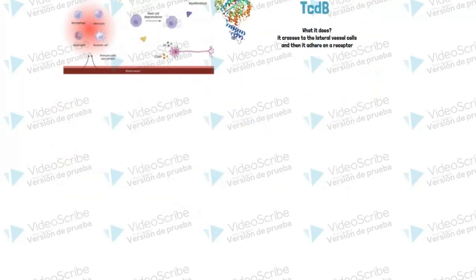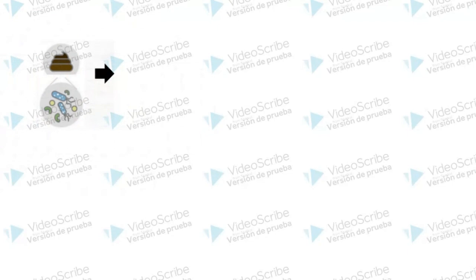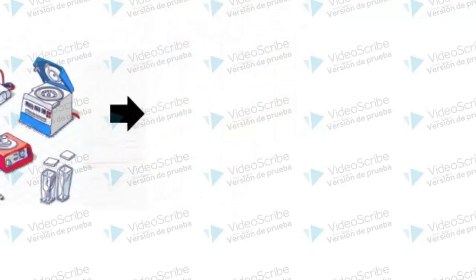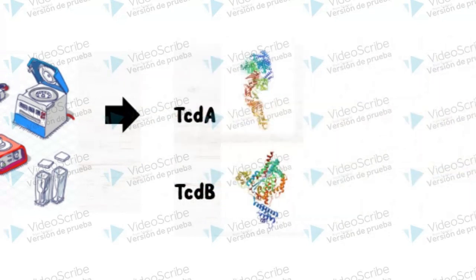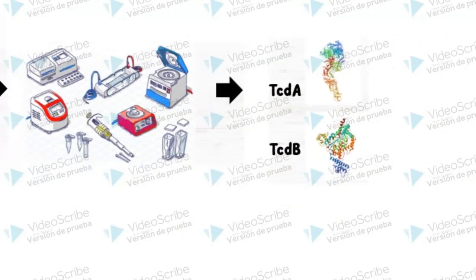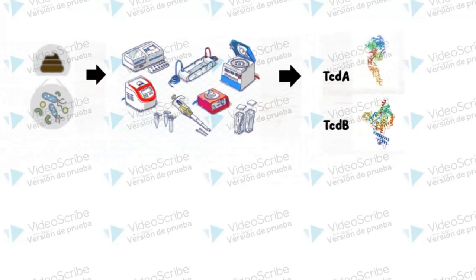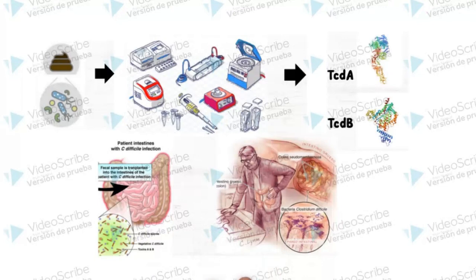Using the PCR test on a stool sample of the patient, it is possible to identify genes from Clostridioides difficile and know what type it is, the producer of TcdA or TcdB. The PaLoc contains genes for 4 additional proteins, TcdR, E, L, and C, which are thought to play a role in the regulation of toxin expression and secretion. The TcdA and TcdB genes are transcriptionally activated by TcdR. TcdR is influenced by environmental changes, such as changes in temperature and nutrient availability.